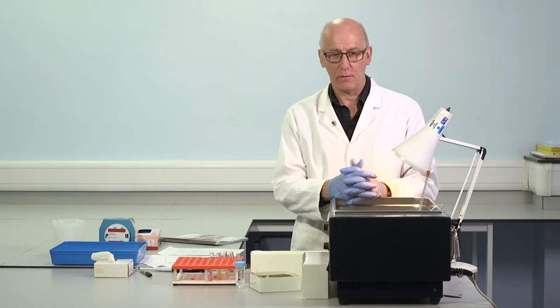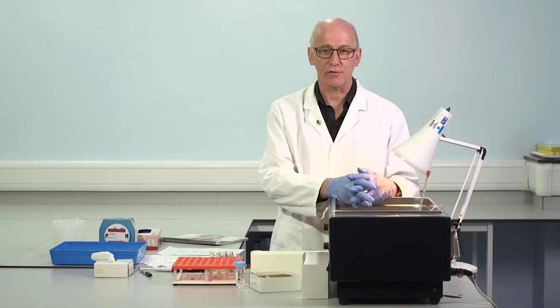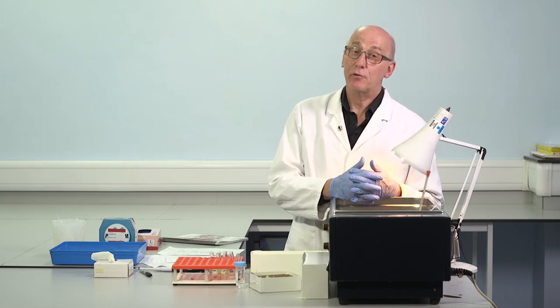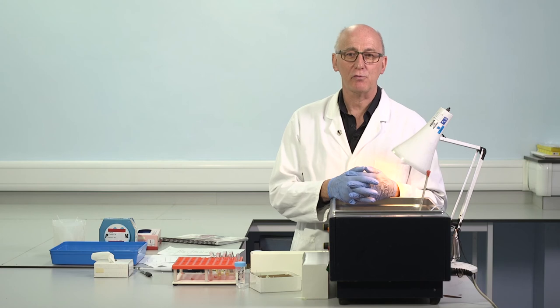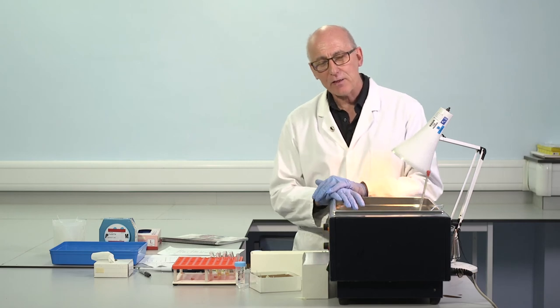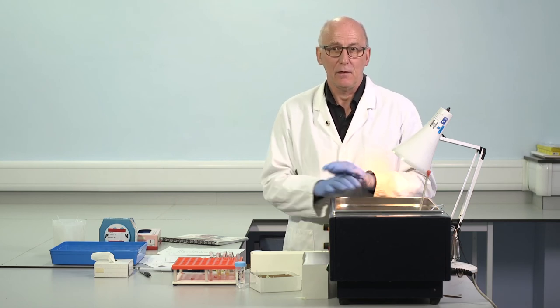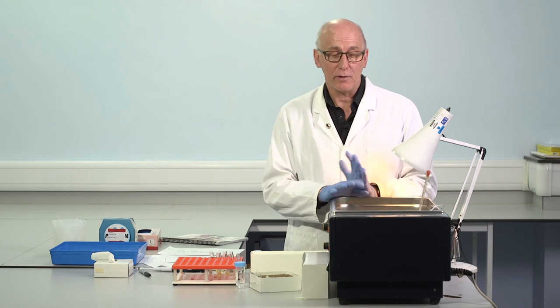The main cause of differences between APTTs performed with different reagents, the most frequent cause of a big difference, is lupus anticoagulant, for the reasons I've mentioned; it's all about the phospholipid concentration. But there is a second, much rarer, defect in which we do see quite different APTTs according to the reagent. And that's patients who have prekallikrein deficiency. It's a rare event. In my center, we've seen two or three over the last 10 years, testing 200 patients a day for APTT. So it's a rare event. But it's in the literature, and we noticed the same.